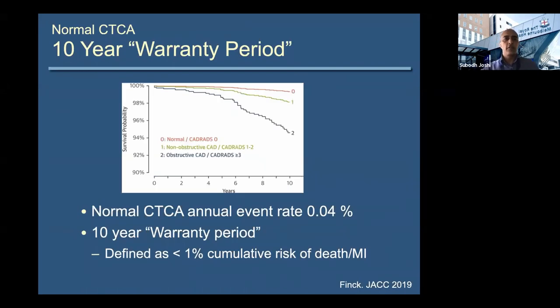So the flip side to CT being so sensitive for atherosclerotic plaque is that if your CT is completely normal, that's by far the most reassuring non-invasive test we have. So the warranty period is now described out to about 10 years, if you define that as a cumulative risk of death or myocardial infarction of less than 1%. So very reassuring.